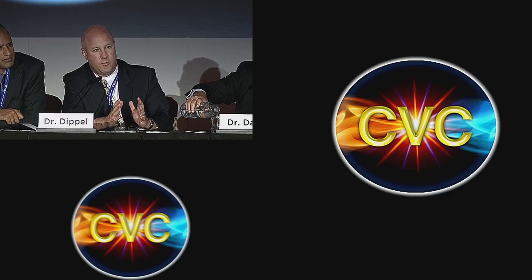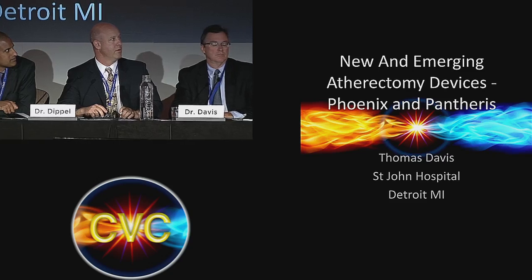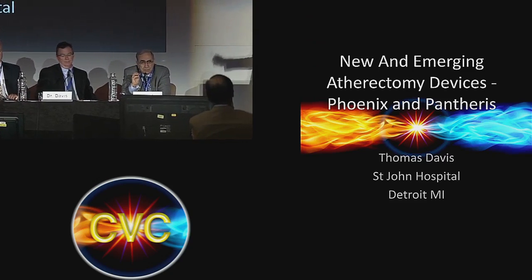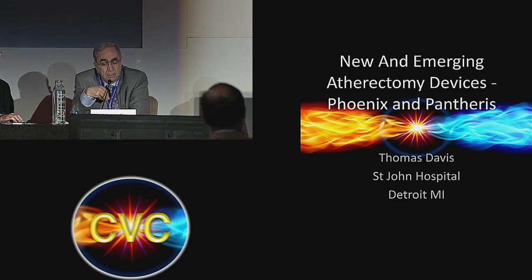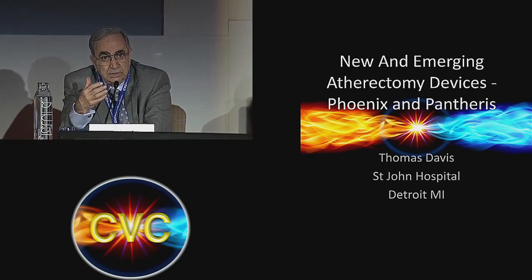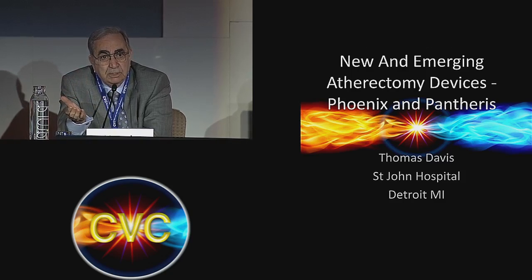I think it's variable, and I don't think that it's a difficult answer. I would say the biggest thing is to have a collaborative discussion with your surgeon. Look at the pictures. There is no uniform situation. What works for one patient might not work for the other patient. So you have to evaluate every single artery on its own merit. If you have a very small popliteal artery, I don't care what you do to it, it's not going to stay open that long.